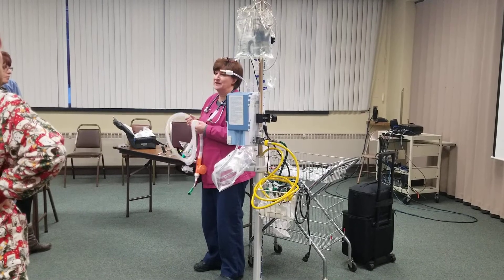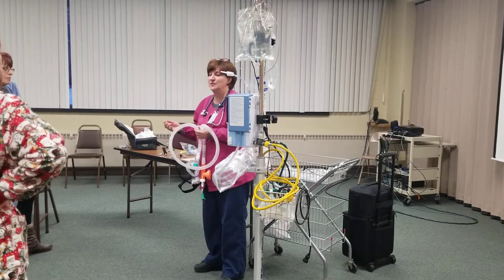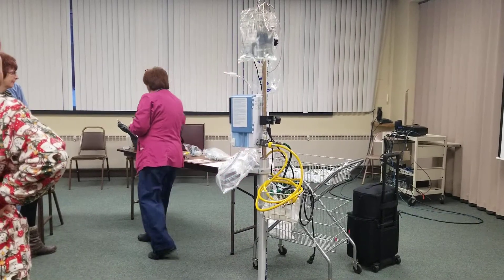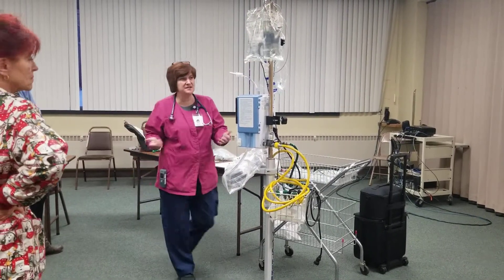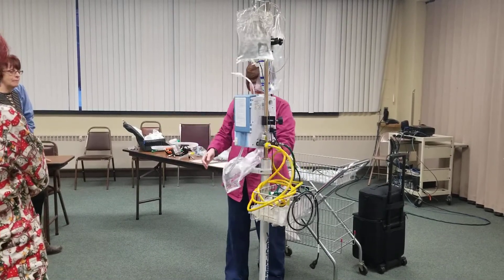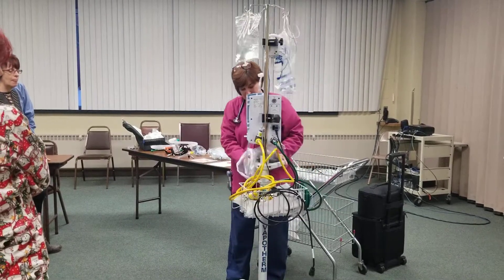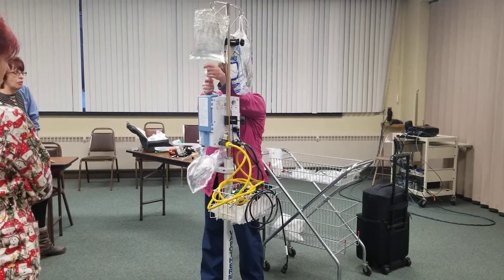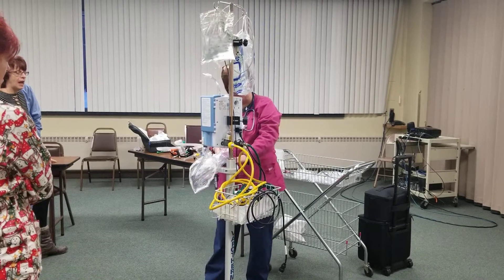That will give you time to maybe get some fluid off of them or something like that. So with the Vapotherm, how do I set this up? Do I need oxygen? Do I need air? I need to spike and plug it into an electrical outlet.